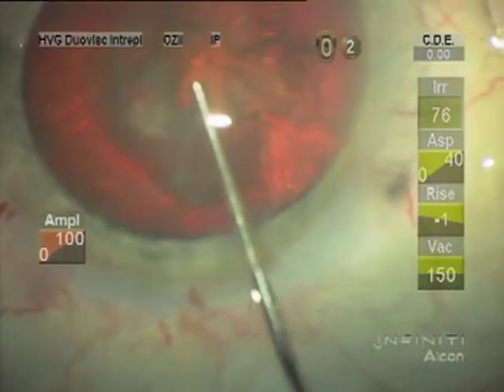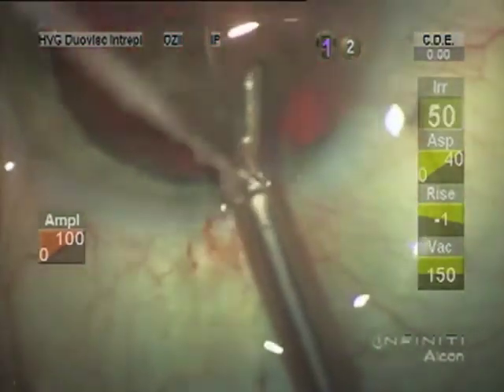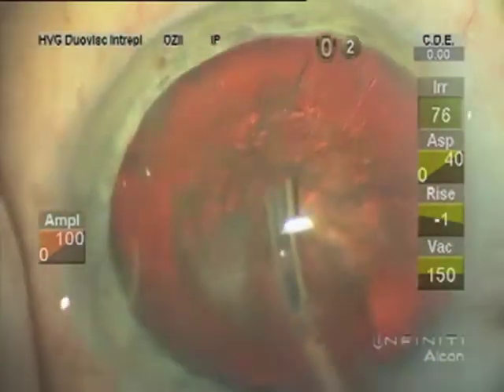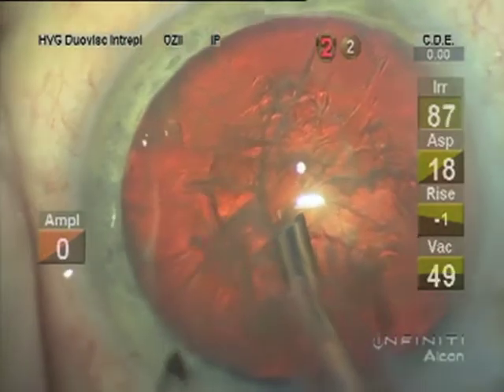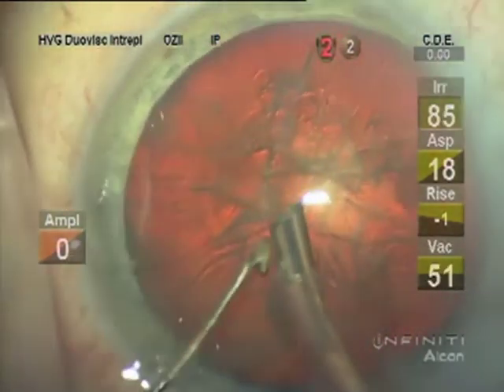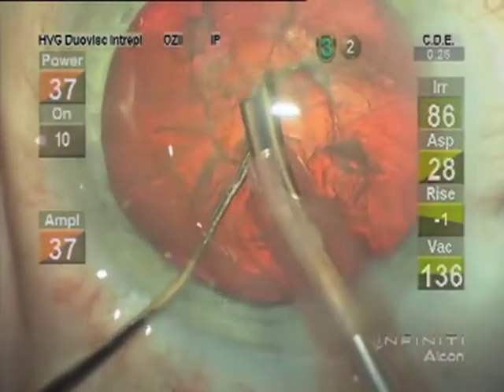I now use the reverse softshell technique, or modified softshell technique, with a little Provisc that allows good irrigation-aspiration with no blockage for wound burns, and also a nice dome in the Viscoat for better visualization.